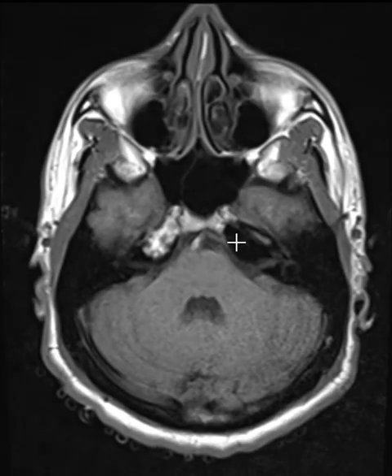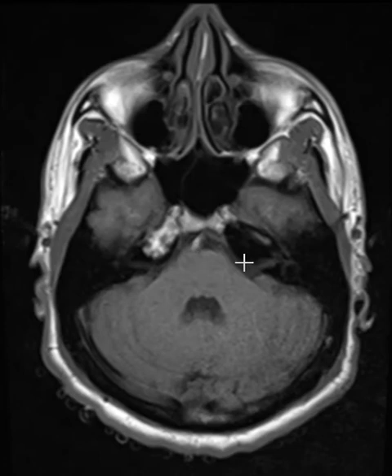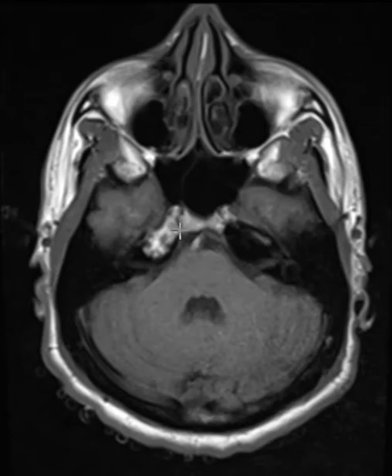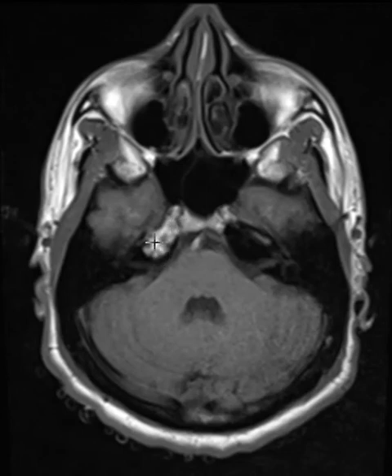Over the years I've had lots of radiologists ask about this — it is a very common finding. One minor caveat: there's something else that could be bright on T1-weighted images — a process called cholesterol granuloma, where the cholesterol is hyperintense on T1, just like this. But those, instead of being so nice and uniform with a sharp margin against the normal bone, would be a larger, more expansile mass that might grow around the area and look significantly different from this well-defined, mottled area.